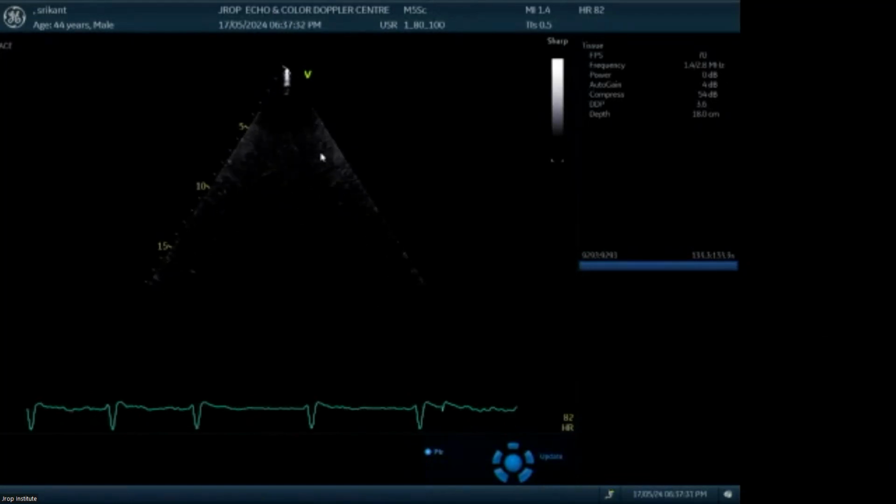Good evening, sir. I have a query. How are these ECG leads applied? These are the three leads. They are attached to the echo machine. It is only available in echo machines, it's not available in ultrasound machines. If you're doing an echocardiography on an ultrasound machine, believe my words, all your diagnosis would be wrong. Okay, sir. All right, thank you, sir.